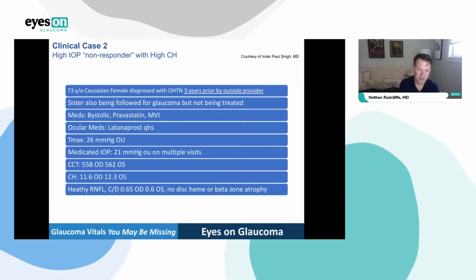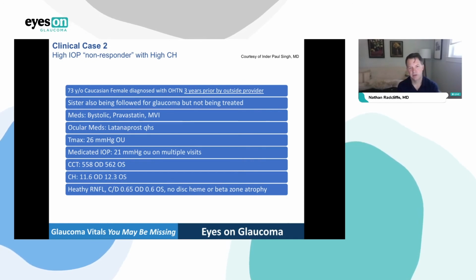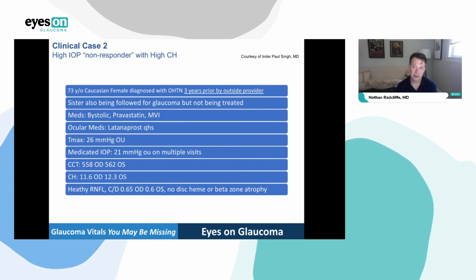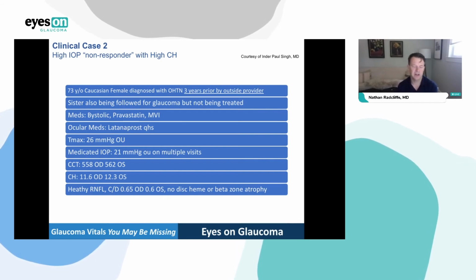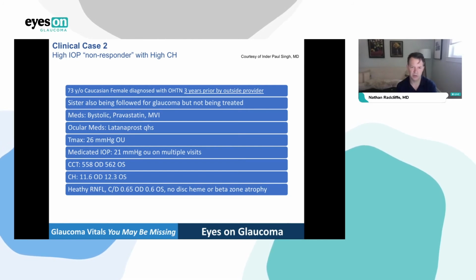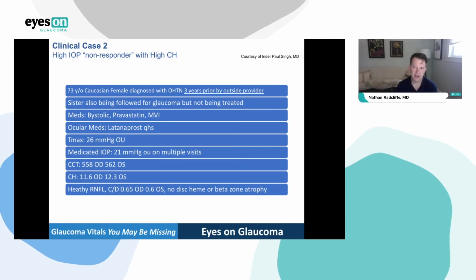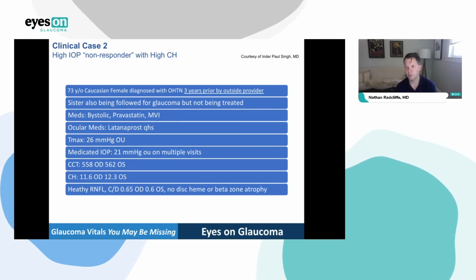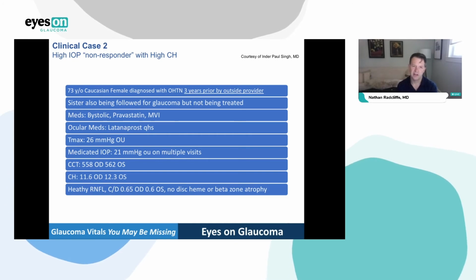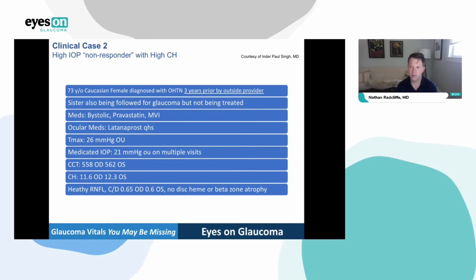What do we think about this patient? And I see this all the time from my colleagues, maybe who don't have hysteresis, and a lot of them want to add another drop to that patient who couldn't get their pressure below 21. They're thinking, I don't get it. Latanoprost should have brought them down more. Maybe this means their glaucoma is more serious. And one thing I always step back and say, your ability to get the pressure down and the seriousness of their glaucoma are often two different things.